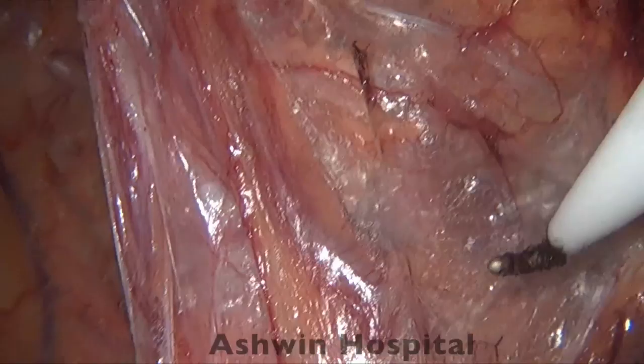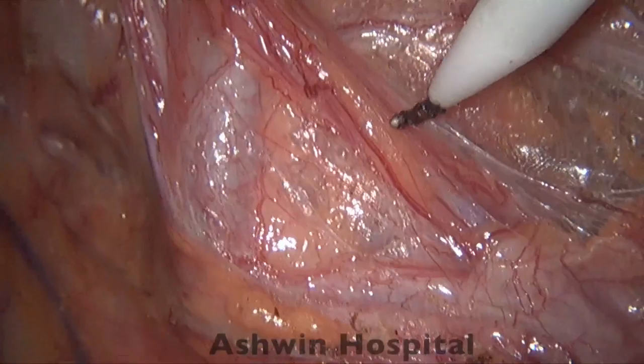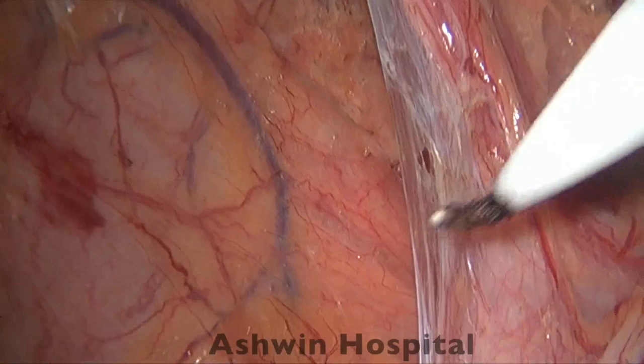So here you can see how we are trying to dissect even further and make sure that the peritoneum is nicely pushed away. You can see how the edge of the peritoneum is clearly visible, and we just hold the edge and keep applying traction away so that we can see the structures well and use the cautery in a safe manner.